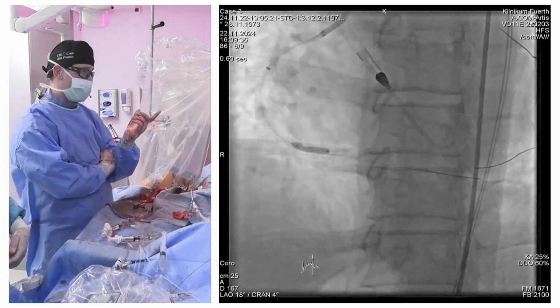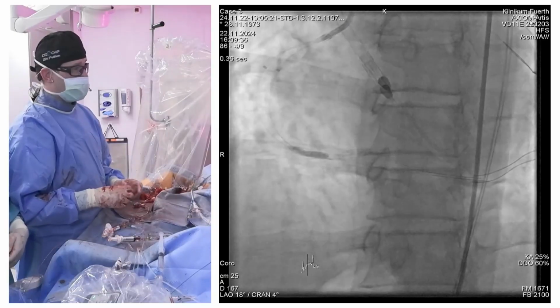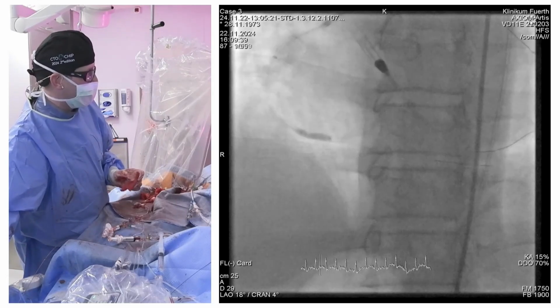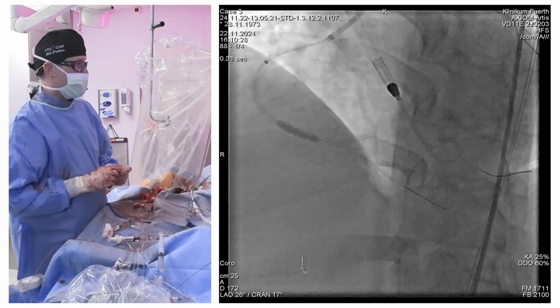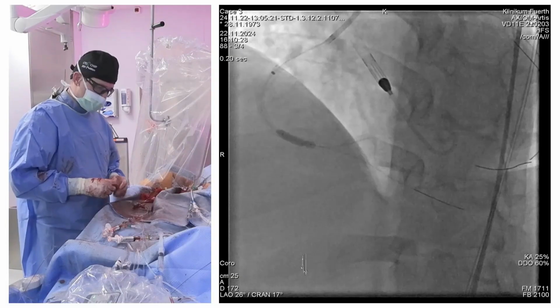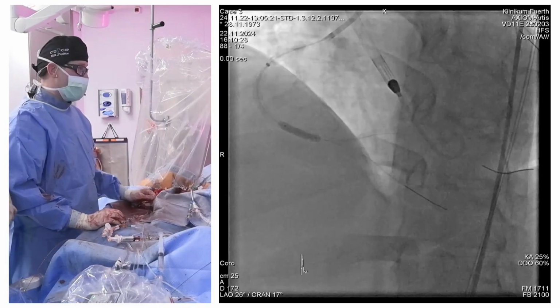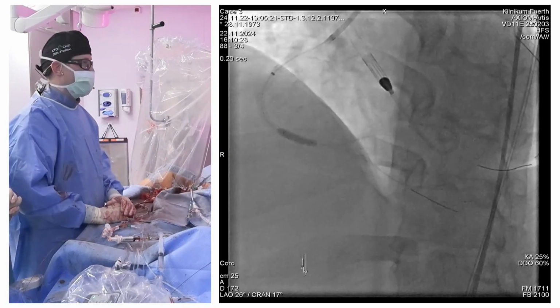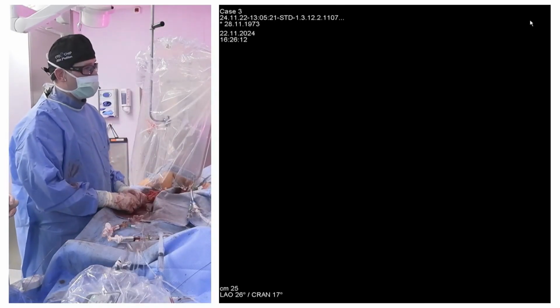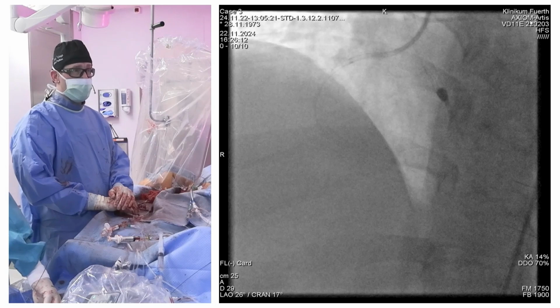So this was the part where it was giving us a hard time, where we always deviated and exited the stent. And this is a dilation with 18 atmospheres, and with 20 atmospheres it eventually opened. And this is probably the mode of failure in this case. If this would not have opened, you can always think of an ultra-high pressure balloon or IVL, of course. Officially, we are not allowed to do IVL in stents, but it's working relatively well, and especially it's giving us the opportunity to treat calcium, even though it has not been treated before stenting.